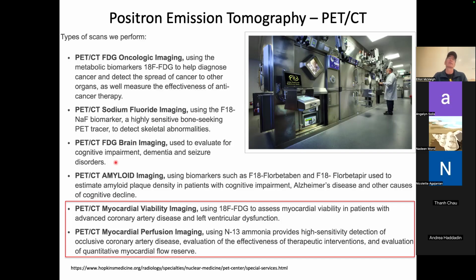It was used before fMRI to image the brain during cognitive activity to look for flow differences in cognitive activity, right? Turns out basically functional neurological MRI is much cheaper to do, and anybody can do it on their MRI scanner.